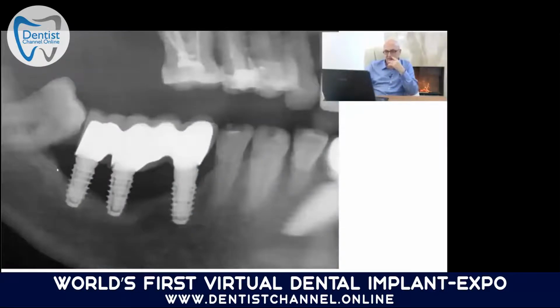The same here, you see the implants are without bone until the area where the basal bone starts. You see a little bit more white on the picture here, a higher mineralization. So this is the border to the basal bone, and these implants can stay like this more or less forever, as long as the basal bone line remains at this height.